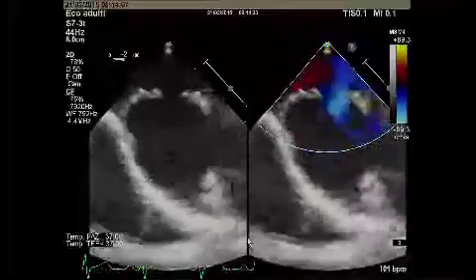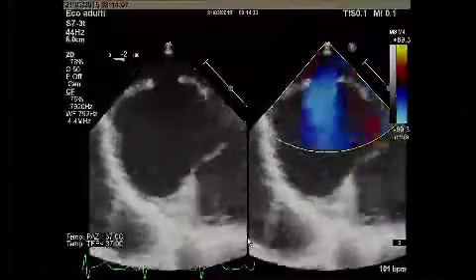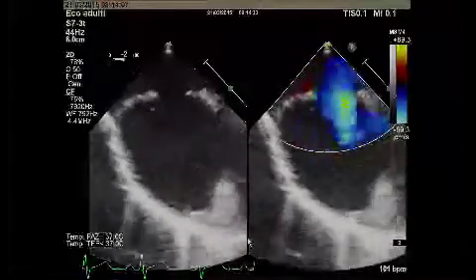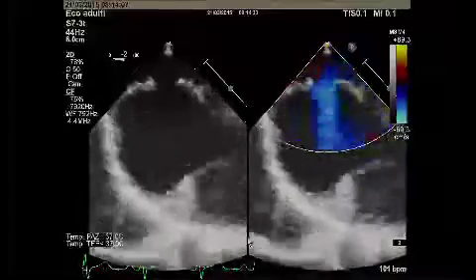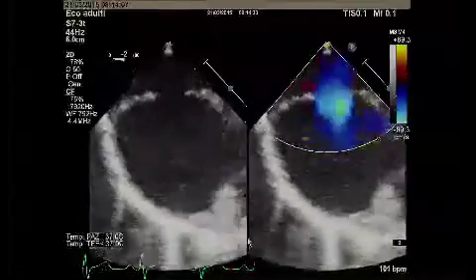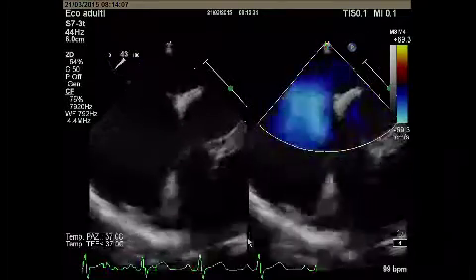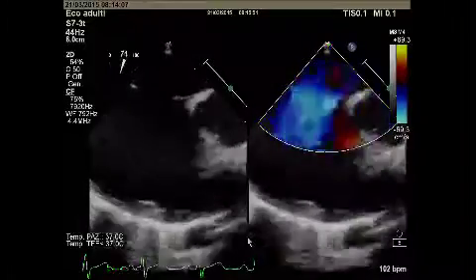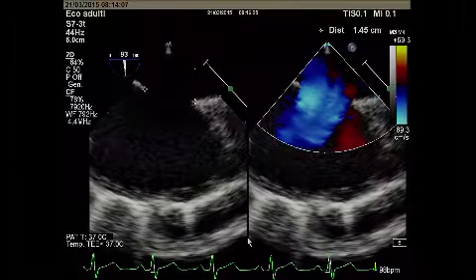So we use the biplane here because the patient is relatively small to put the multiplane probe. And we got several pictures that we're going to share. So, moderate size ASD, left to right shunt. It's definitely one part of the septum itself is more floppy than firm. So we'll give you the measurement pretty soon. We went to a bicaval view also, and here is the aortic rim that looks pretty good.